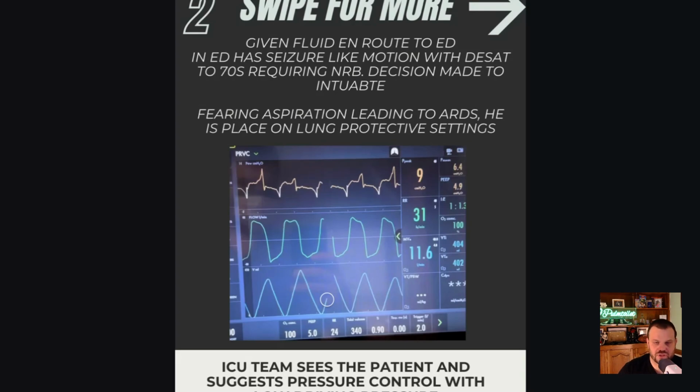So as far as the safety goes. If I have a 7 ml per kg breath and my plateau is 30, I have to think twice about whether 7 ml per kg is safe in that patient, which could mean a whole different set of circumstances, especially in the setting of aspiration or pneumonia or whatever. But I think you get the point.